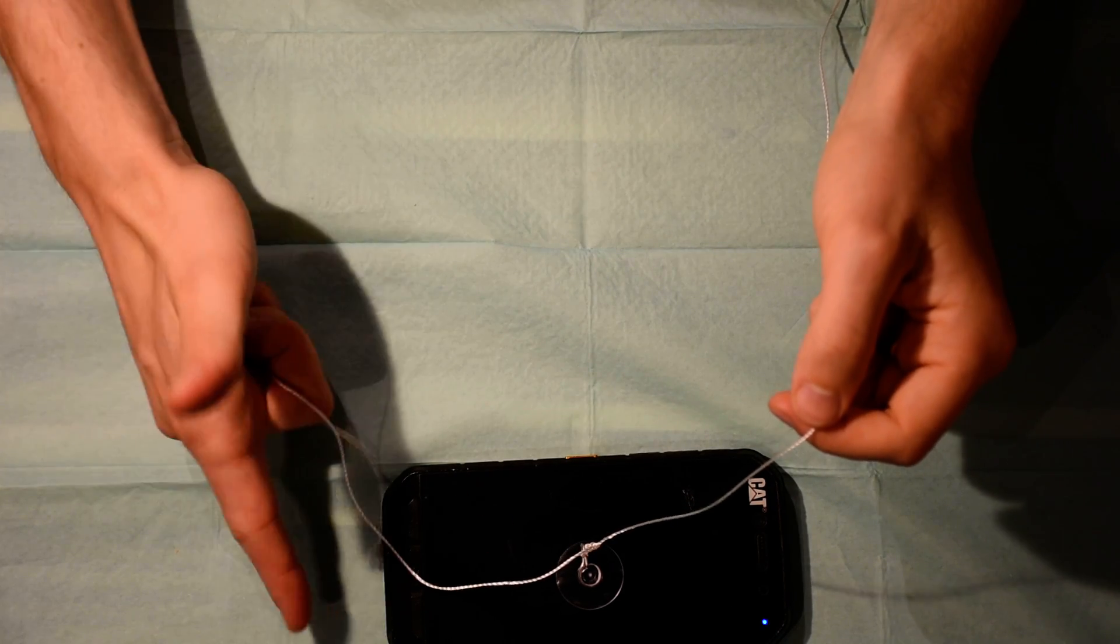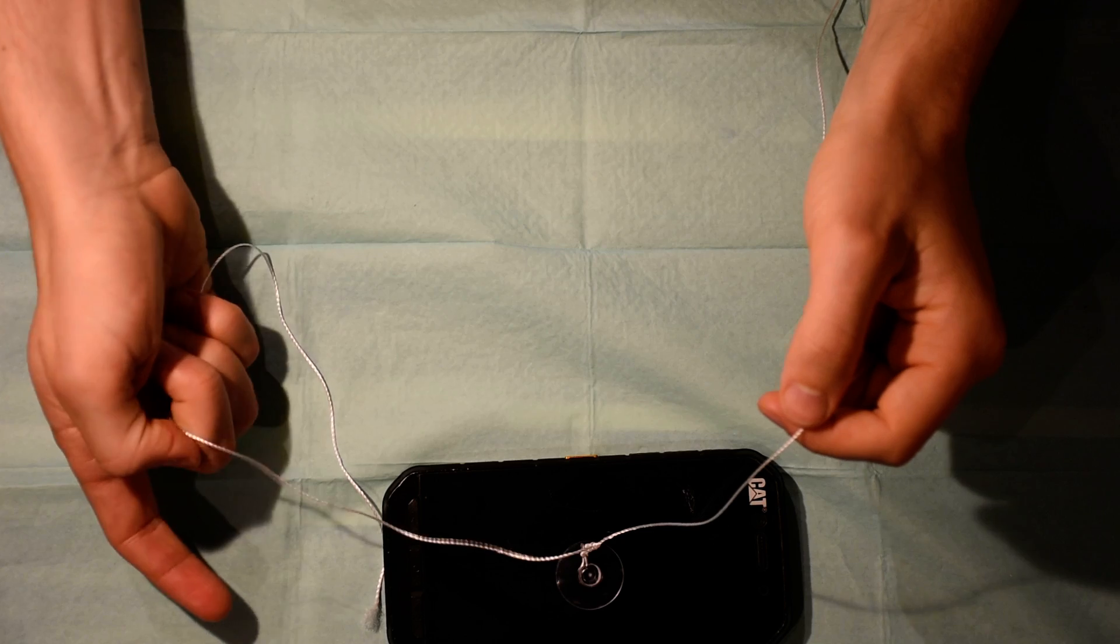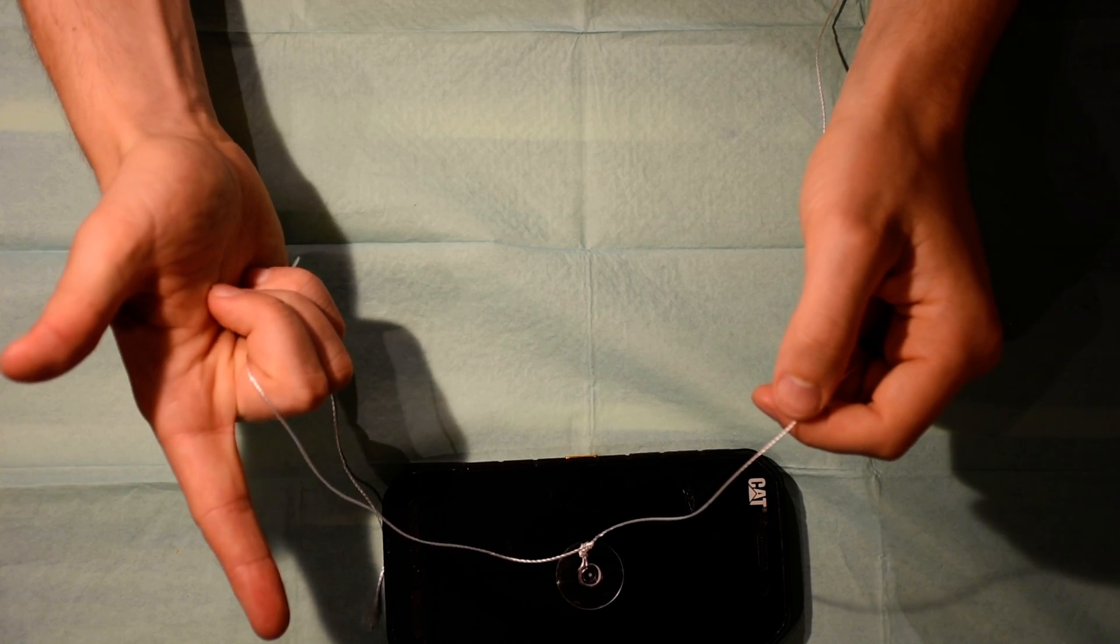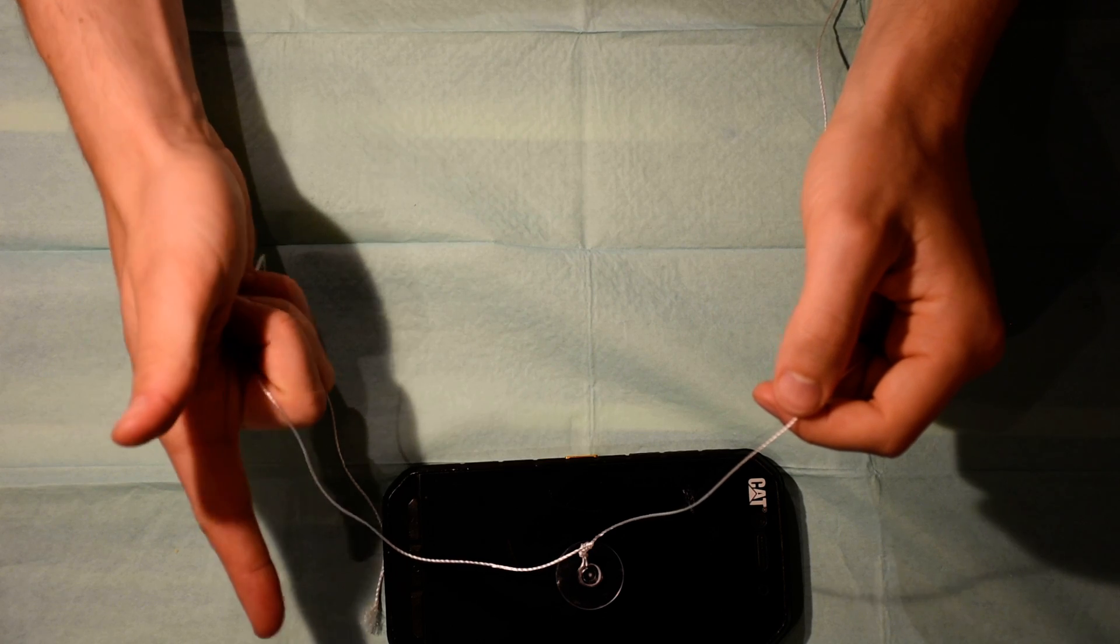You start off with a gun position like this. Take the cord in your three fingers here while presenting your index finger and thumb.